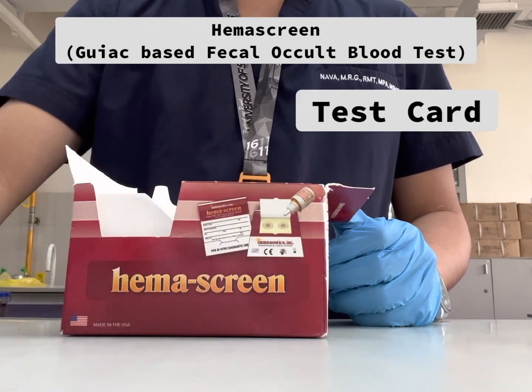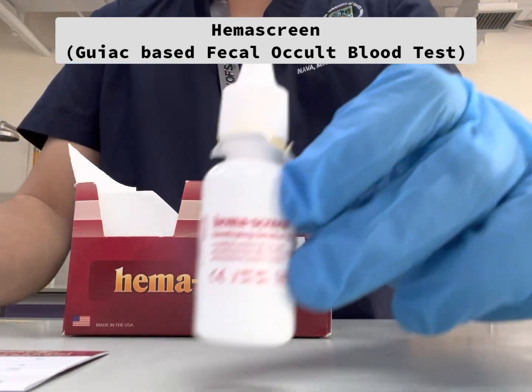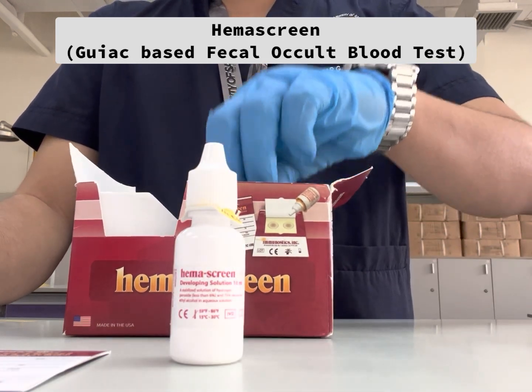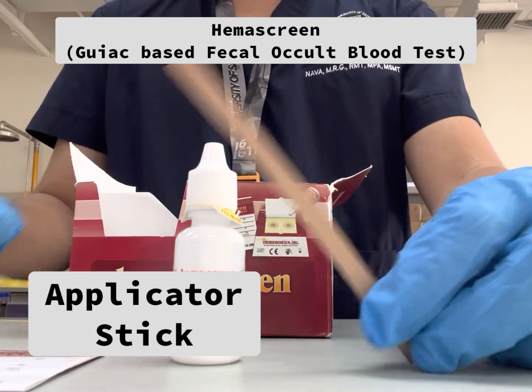The reagent kit includes a test card, also a developing solution that contains hydrogen peroxide diluted in denatured ethyl alcohol. We also need an applicator stick.